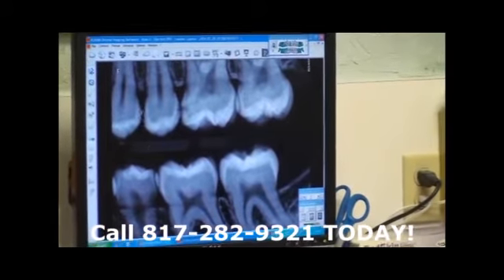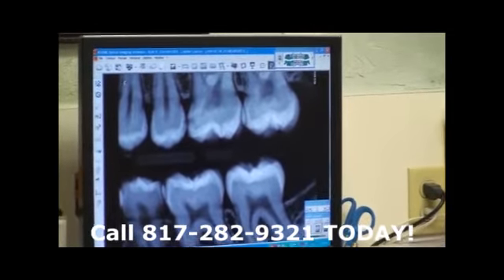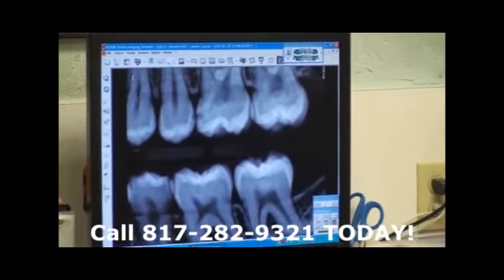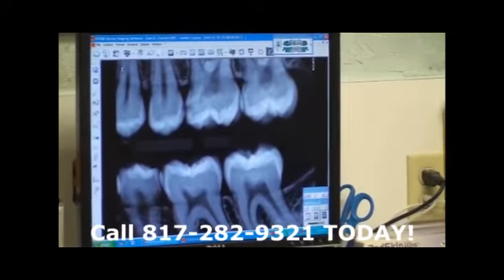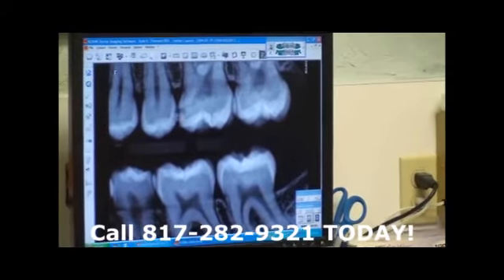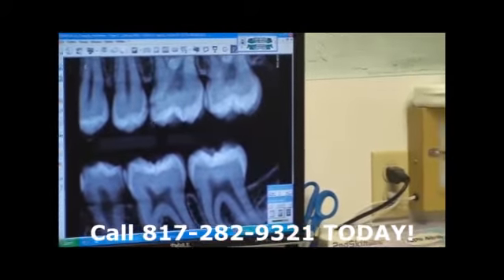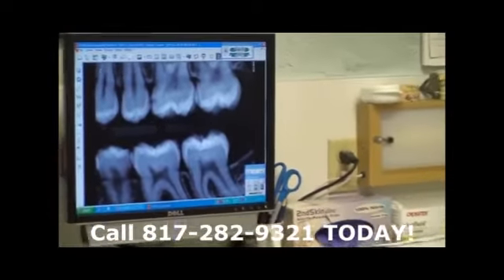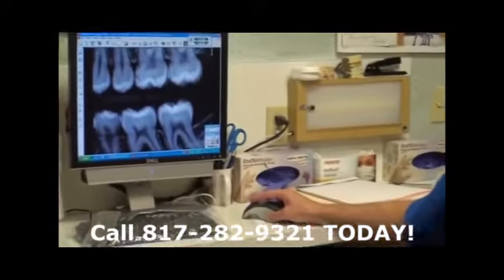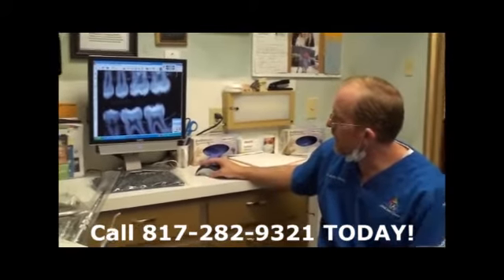Now, over here is a normal tooth that looks healthy, the enamel's all there. This is the dentin, and that's the nerve of the tooth right in the middle. So that's healthy. Now when you look at this tooth and you look at this area here, can you see a difference? Can you see that little shadowy area like that? Well, that's an indication of a cavity starting right there in between the teeth. It goes this way and that way.